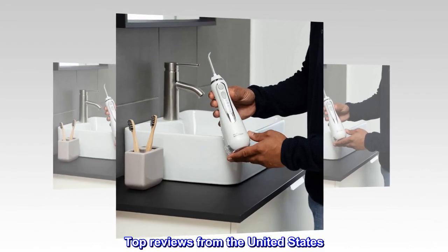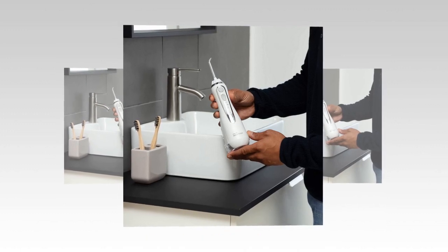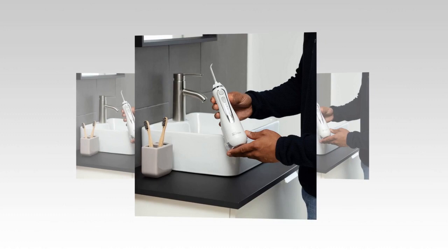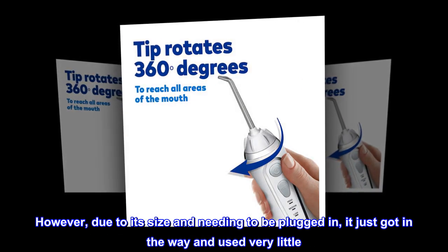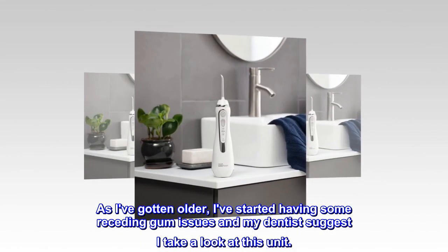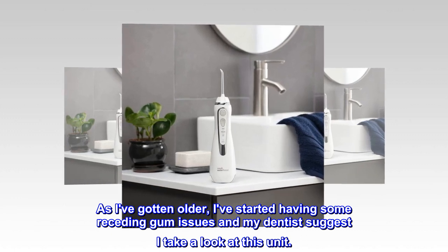Top Reviews from the United States. Should've bought this a long time ago. I've had an old-style Waterpik for a number of years. However, due to its size and needing to be plugged in, it just got in the way and I used it very little. As I've gotten older, I've started having some receding gum issues and my dentist suggested I take a look at this unit.